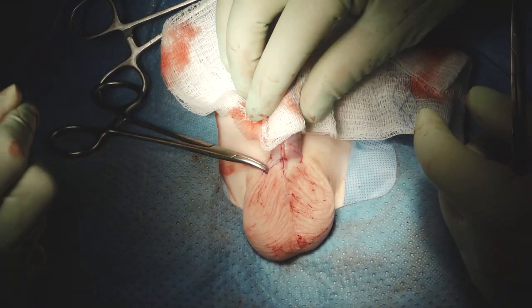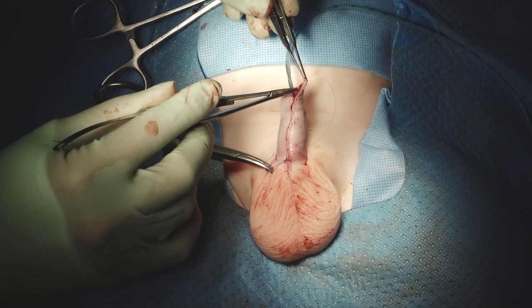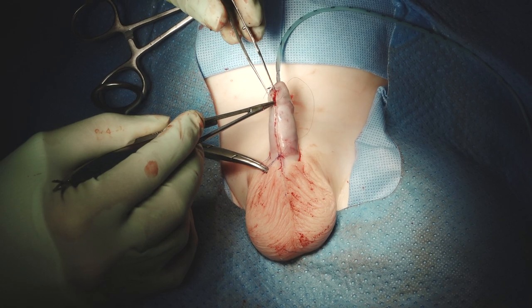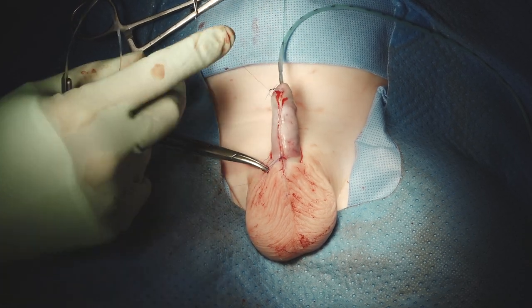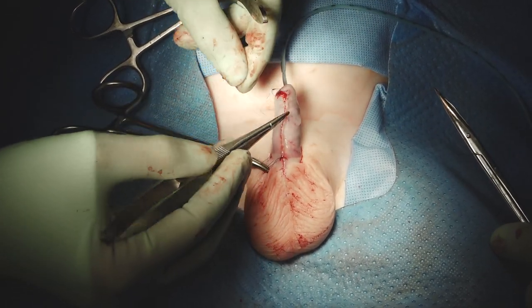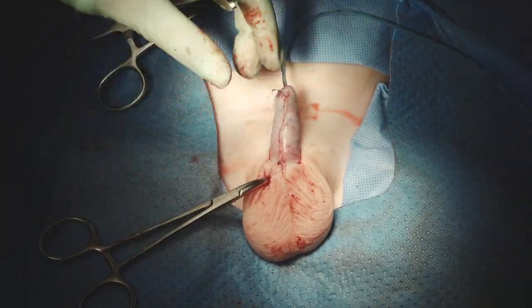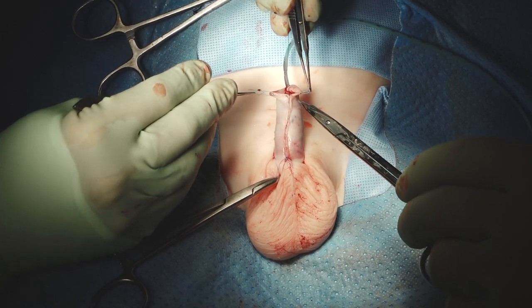You can see that if this family wanted a natural look, well, there it is — it's not hard to do. You just have to cut a little bit asymmetrically, which is why we put these stays but don't cut all the way towards them, because you often have to tailor that for their actual skin, especially when penile torsion is present. When I started doing it, I put the stays in the corners and just cut two of those stays and wrapped it all up. This case shows those stays were in the very corners of the foreskin, but they're not now — they're in slightly different spots.